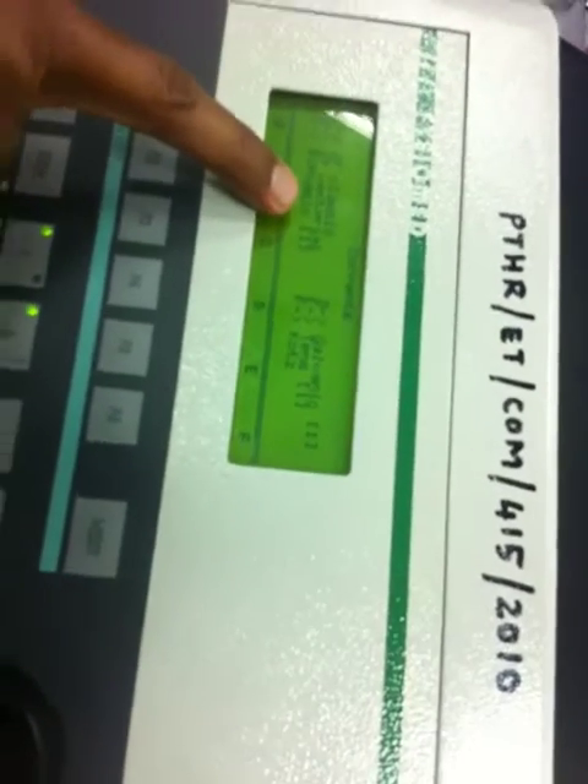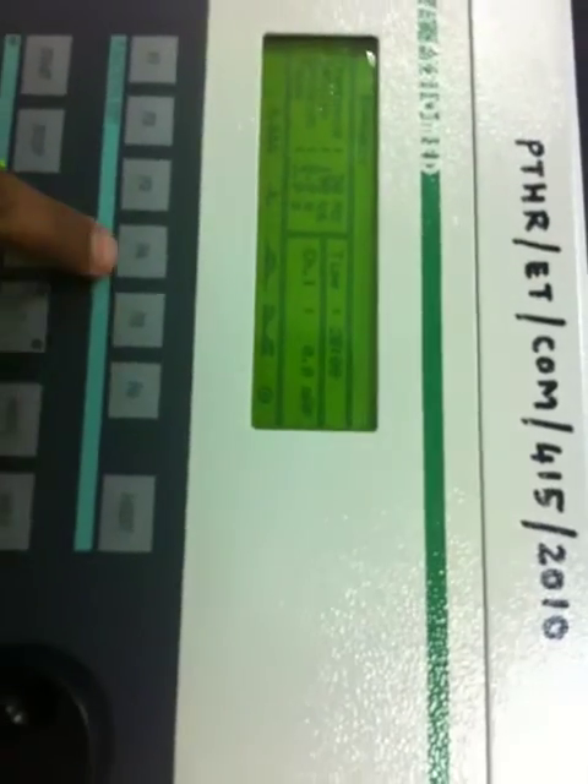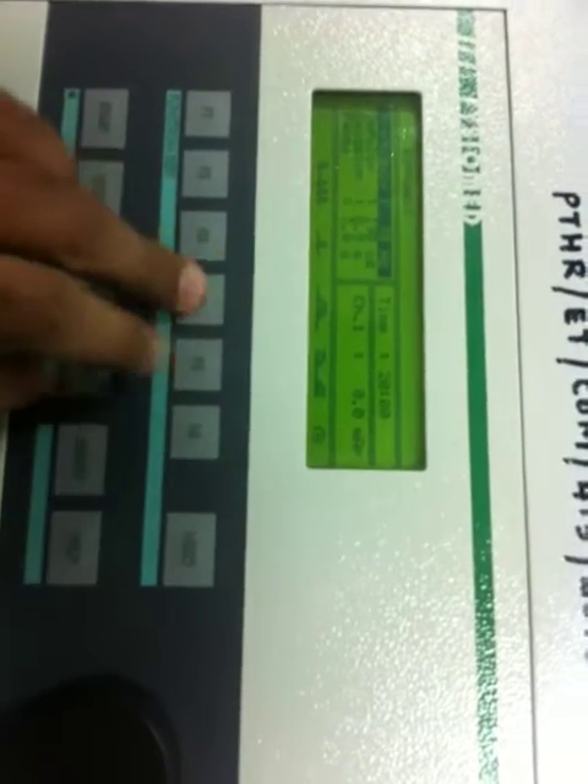We will go with biphasic if it is neuropraxia. Biphasic — this is the same for all. The frequency is between 50 and 100. The impulse is less than 100.